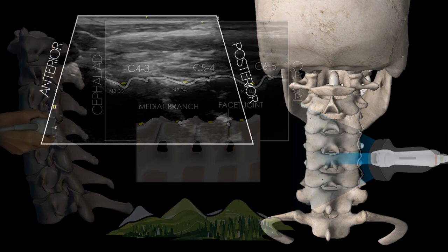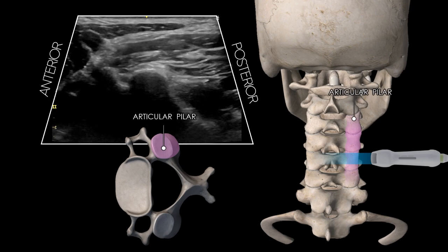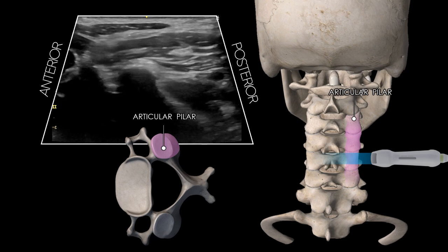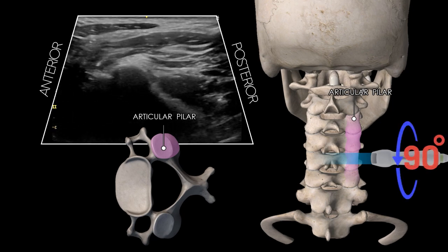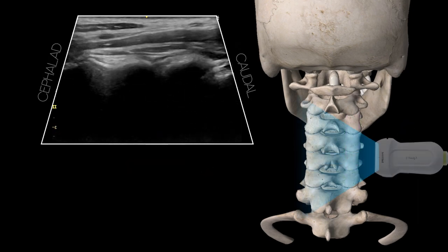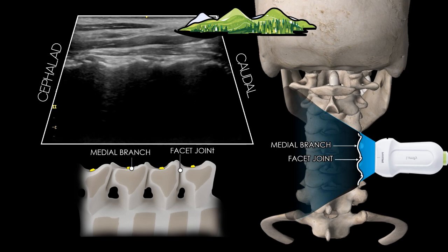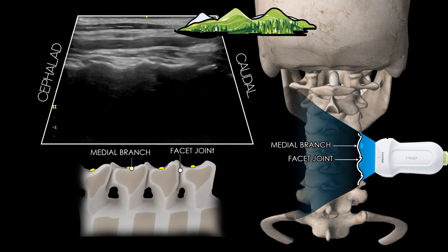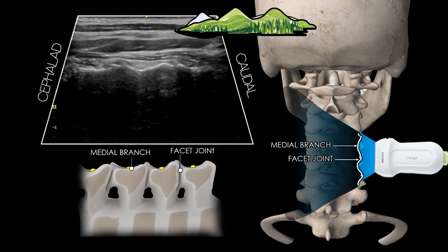In the following real-time video, our observation will commence with an examination along the axial axis. During this phase, we will identify the articular column and the posterior tubercle of its transverse process. Subsequently, as we rotate the transducer to embark on a coronal exploration, we will be presented with an image of the cervical articular pillar, characterized by its undulating mountains and valleys.